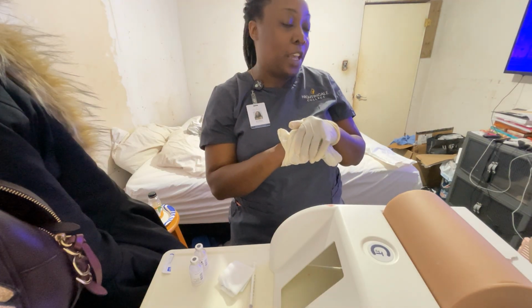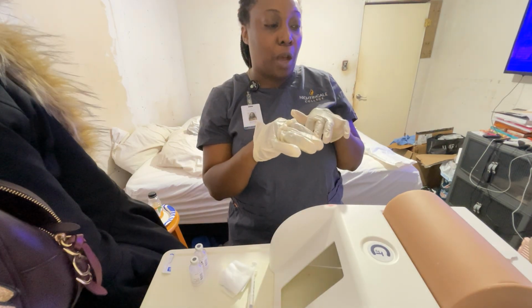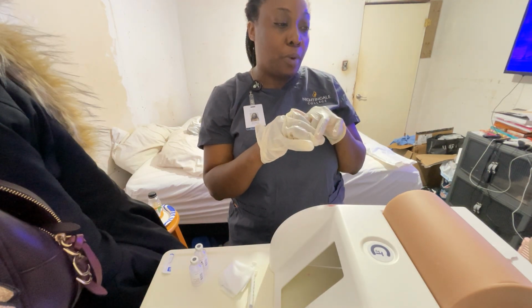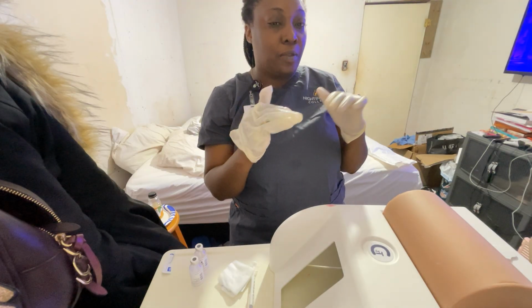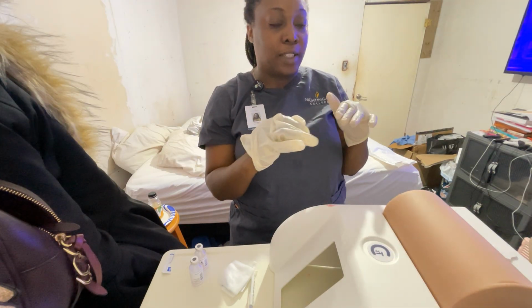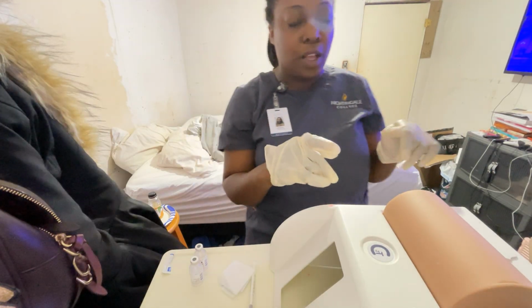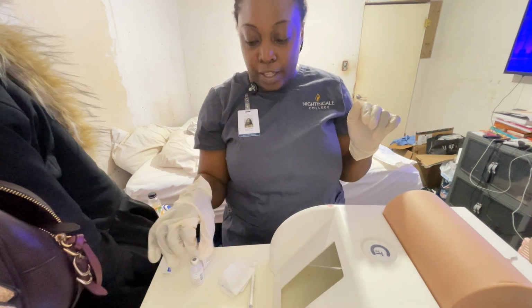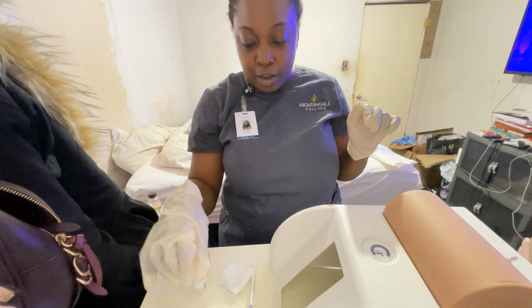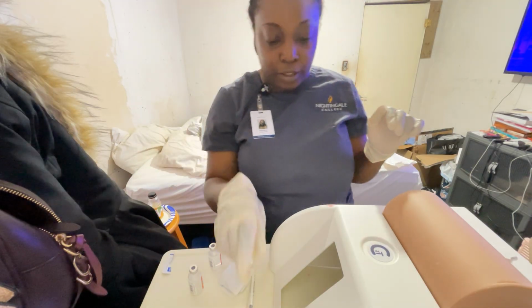Right now it's saying 140, which is very high, and I typically like to see your blood sugars under 100. So 70 to 90 is what I kind of like to see. Since you are so high, I will be administering 2 insulins. Again, it's 4 units of the regular and 8 units of the NPH.